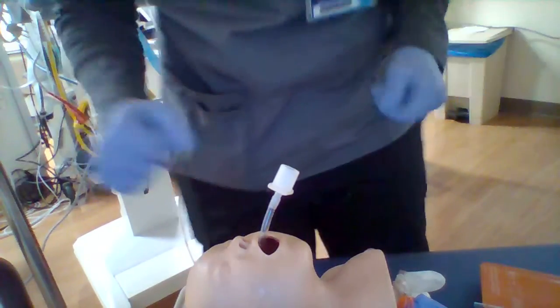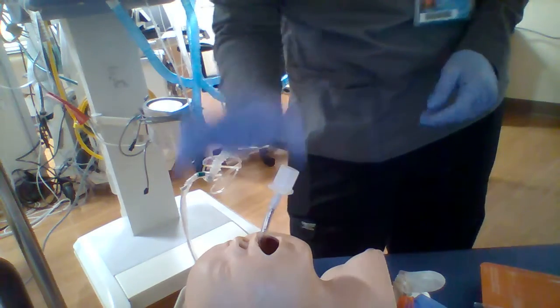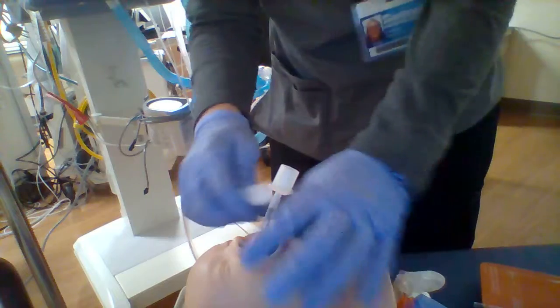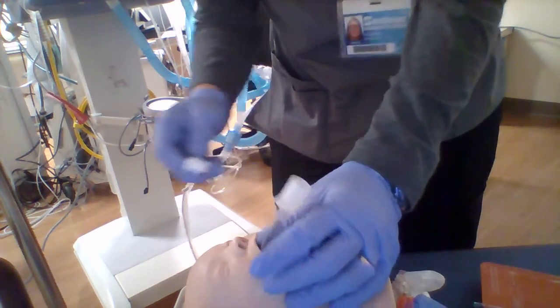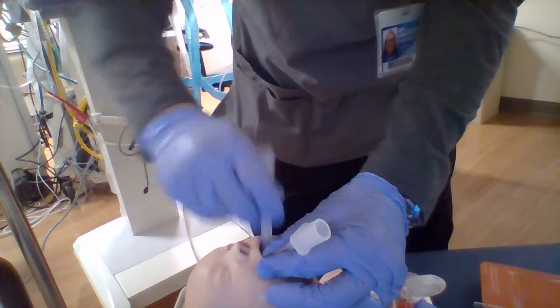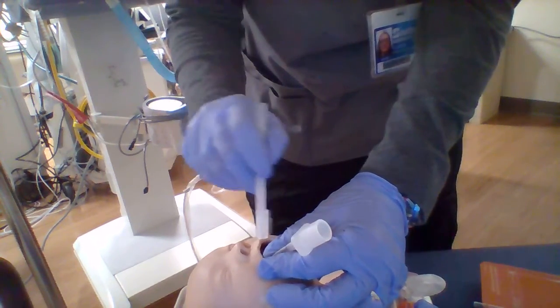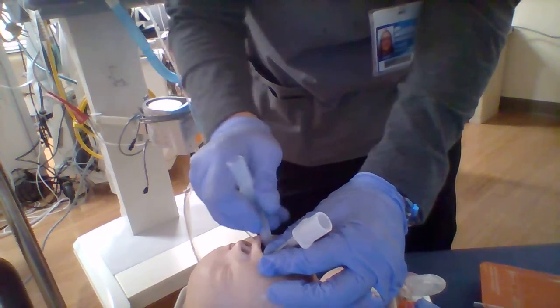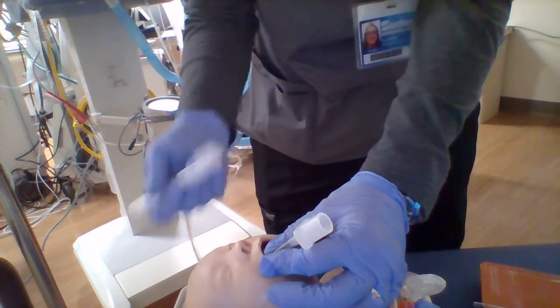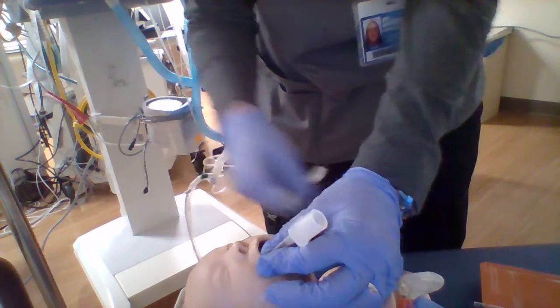So we have mouth care. I have my little wee tiny baby. So I have my baby here, and I'm going to do some mouth care on it. There will be an ET tube holder here. So let's say it started on this side. I'm going to go ahead and clean all of this side. This has the ability to have some suction on it. So start in the back and work my way out. Maybe wipe off whatever with a napkin or paper towel or washcloth, whatever.